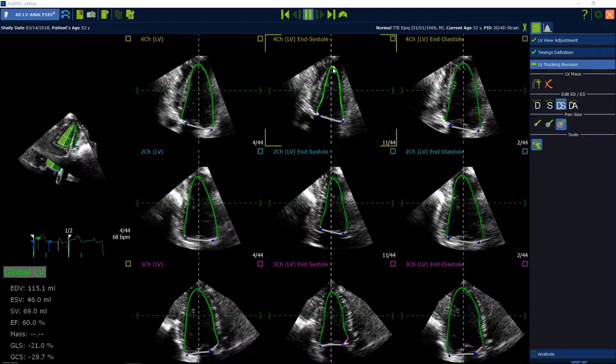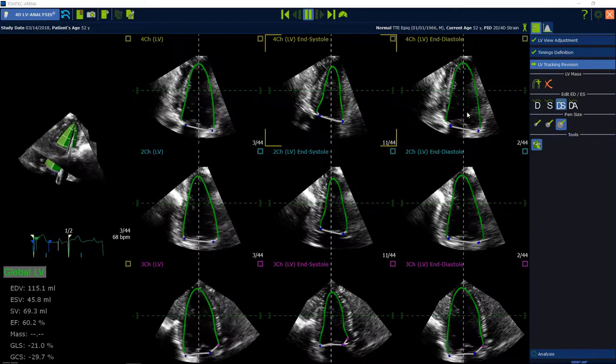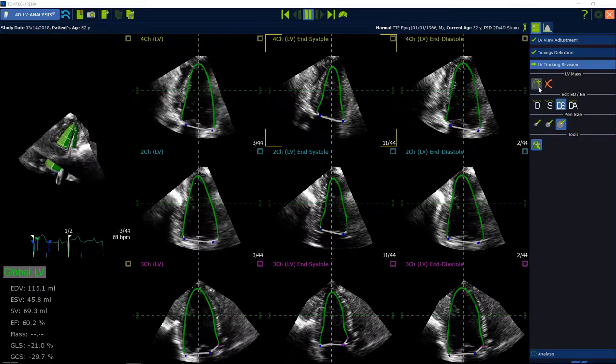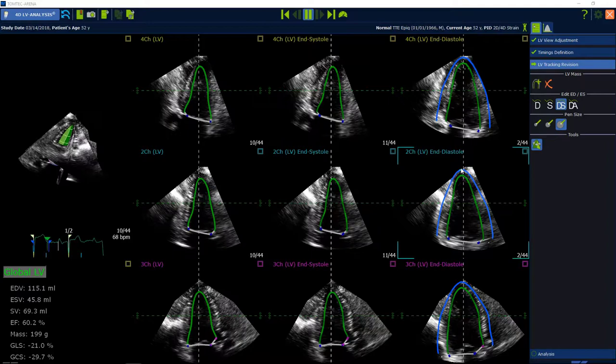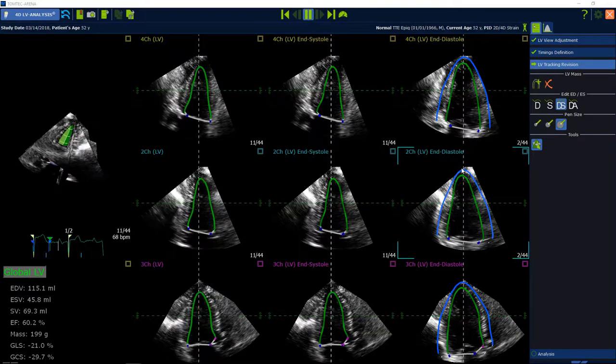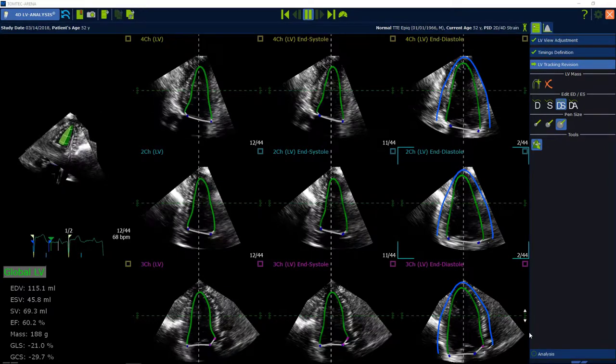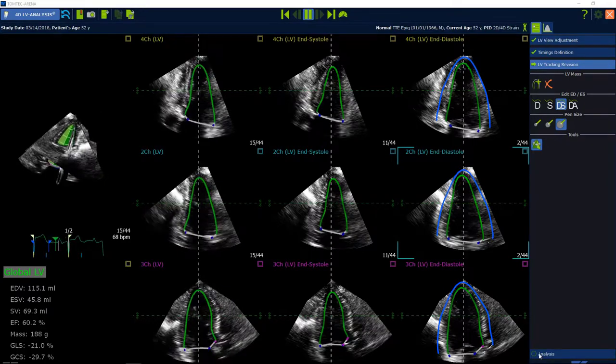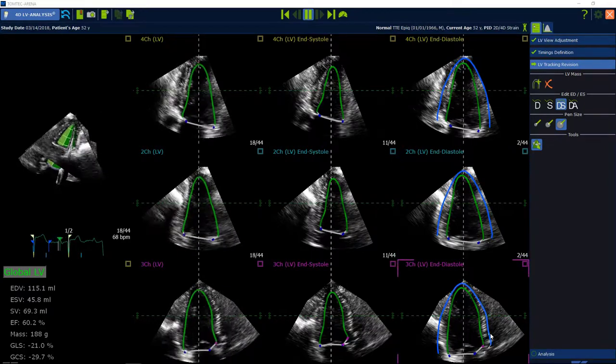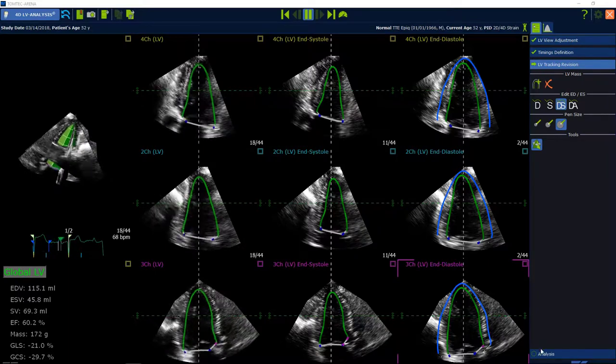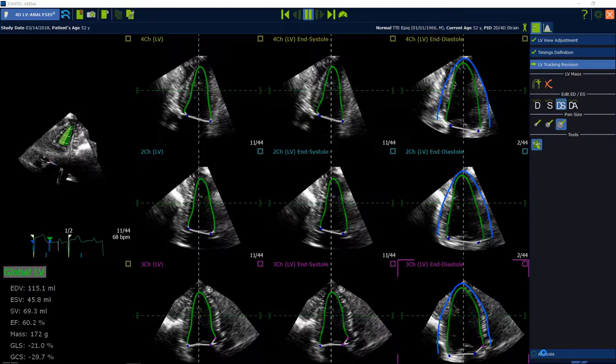Select the Add epicard contour button to calculate the left ventricle mass if the epicardial contour is part of the acquisition. Adjust the blue contour if necessary by drag and drop. Select Analysis to continue.